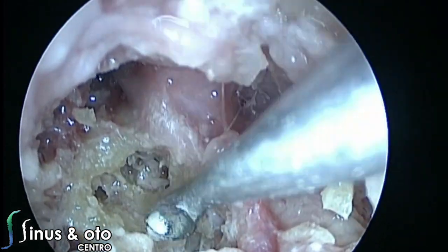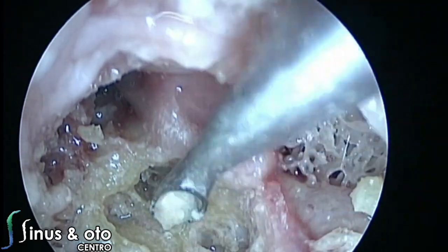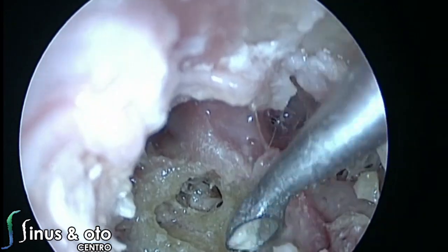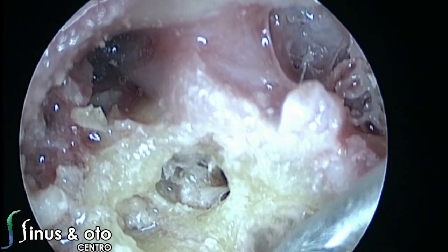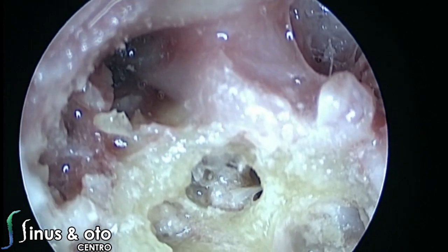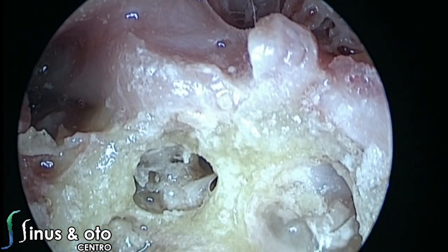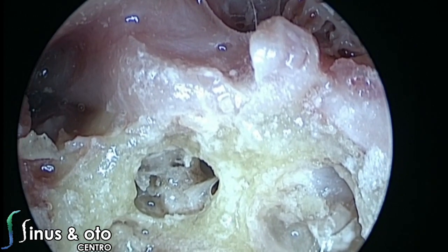And if we drill a little bit down there, trying to unite the cochlea with the vestibule, we will see the fundus of the internal auditory canal. At this point, in a real patient, there's no CSF leak because there's no entrance to the central nervous system. But once we open the fundus of the internal auditory canal, which is the region between the modiolus and the vestibular nerves, we will see the CSF leak coming out.